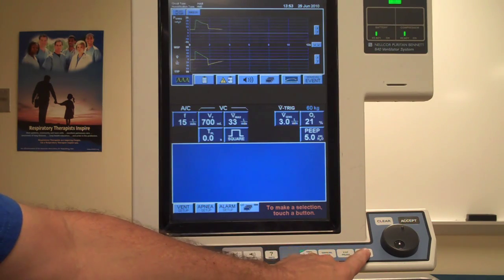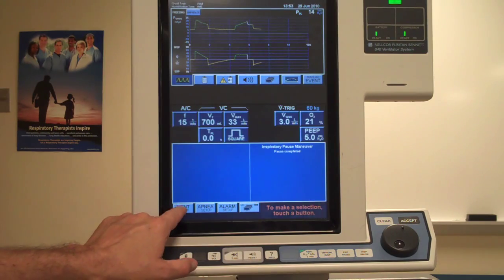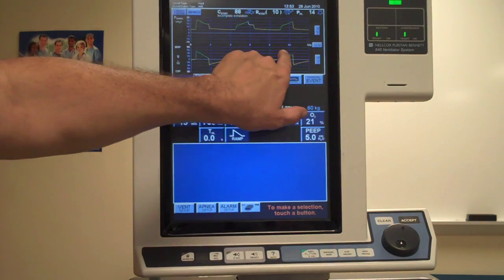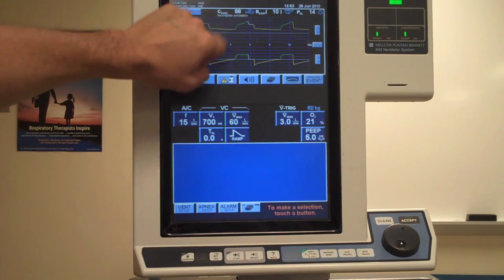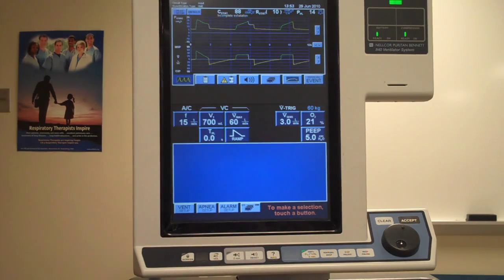I wait until the ventilator delivers that square wave breath, apply an inspiratory pause, then go back and hit vent setup, previous setup, accept. At most we have two breaths delivered at a square wave flow pattern. Through that plateau, it's able to measure my plateau pressure, my static compliance, and my airway resistance. The incomplete exhalation message indicates that the volume placed inside and the volume read back as exhalation had a slight variance, which can simply be due to the test line.